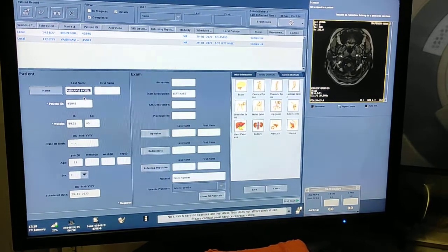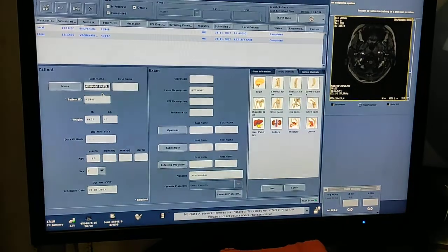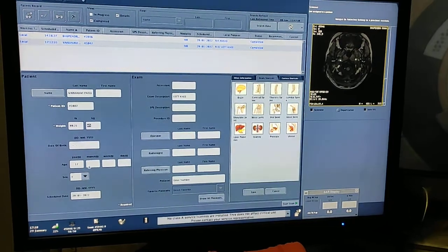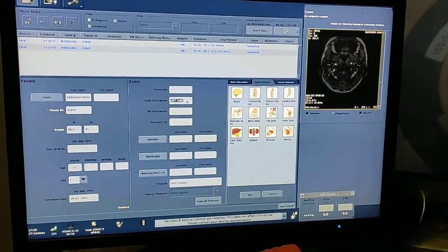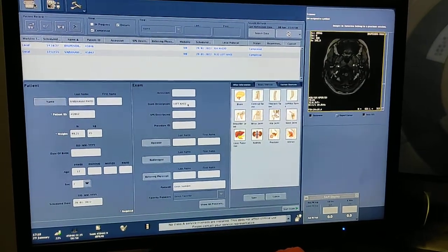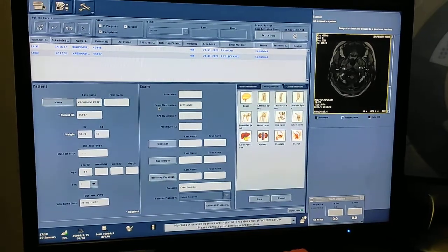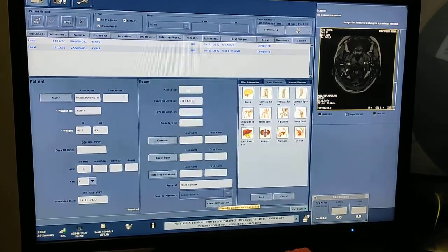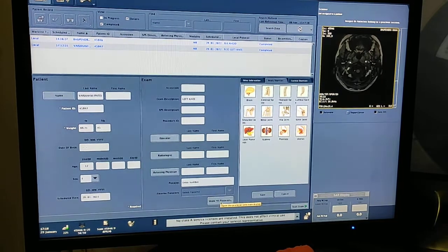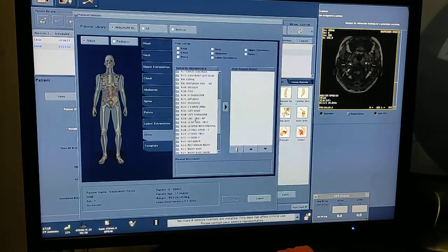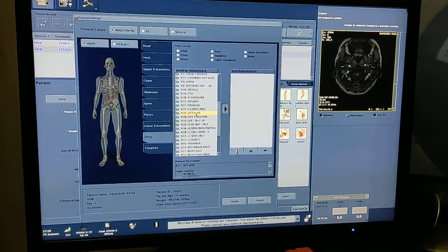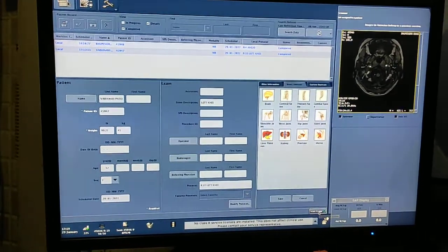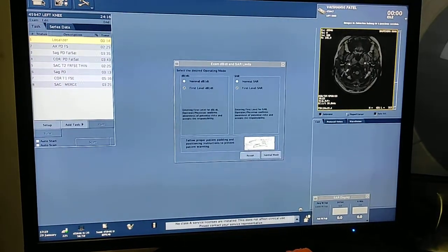We are at the entry desk. First of all, you have to fill the patient data — name, patient ID, and age. Then you have to write down the scan area. This is a left knee, so in the exam description you write down 'left knee.' From here, select the protocol — click on 'show protocols,' select the left knee joint protocol, and click enter, then accept.